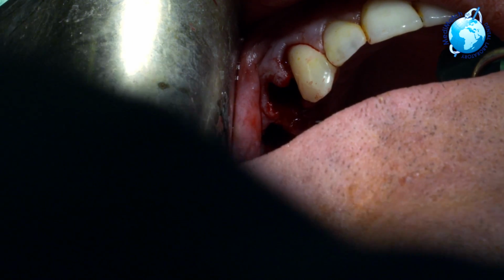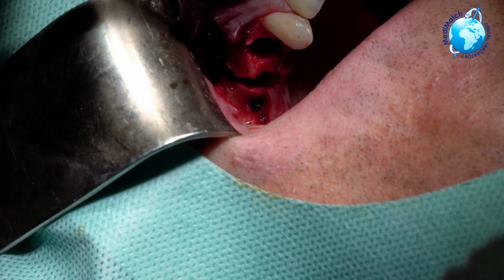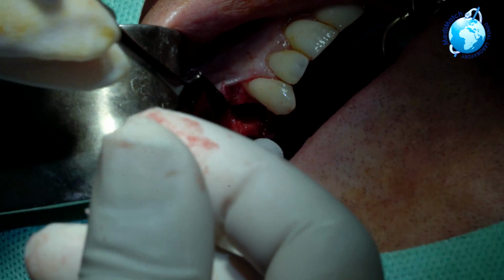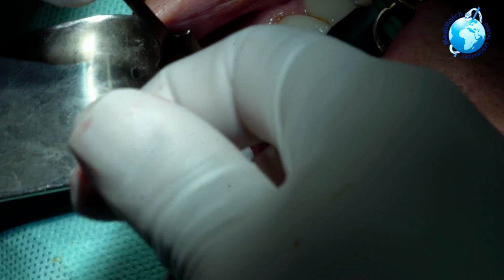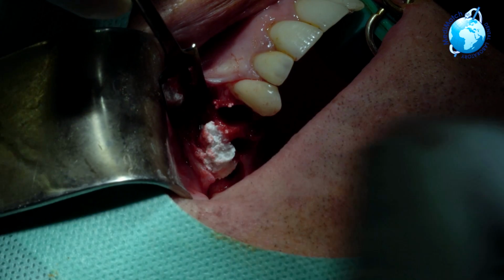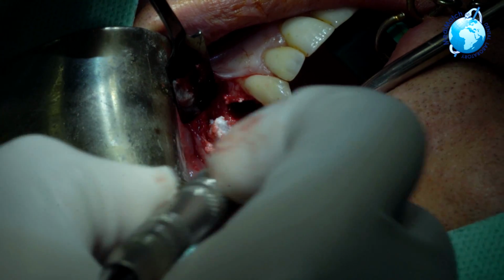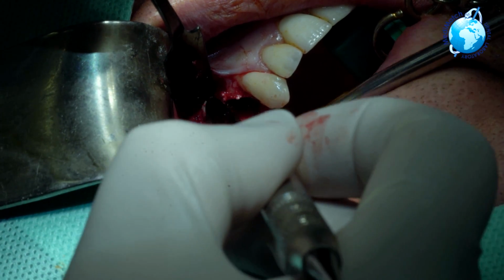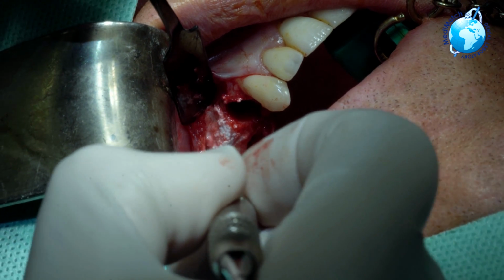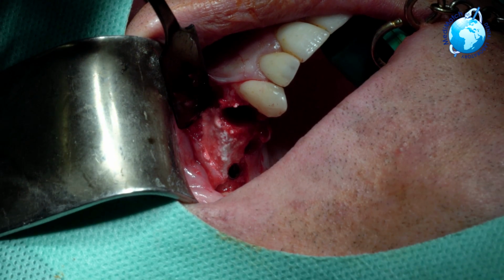Right, so what my lovely assistants are doing now is just retracting everything back. Now using the Ethos, we're just going to inject it around. Do you want to put a temporary abutment on there or healing cap prior to that? Right, so put a little bit there. You get two of the cover screws. I'm just going to put the cover screws on temporarily. Whatever you want to do.